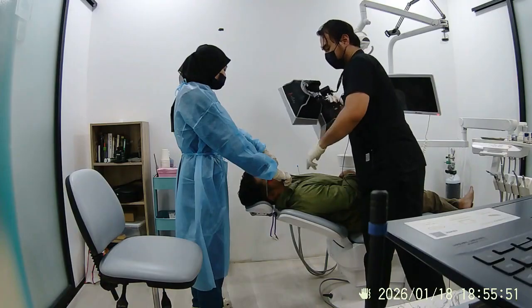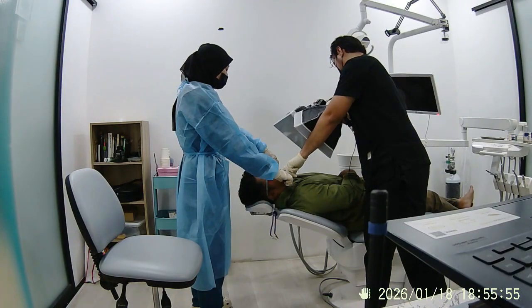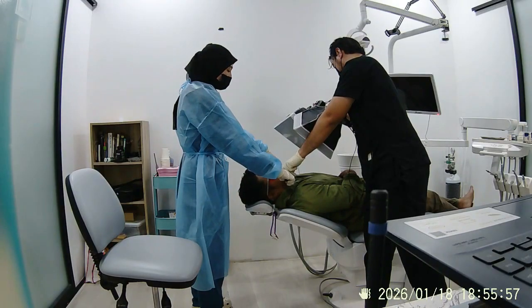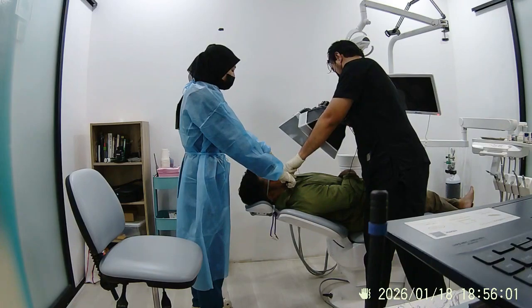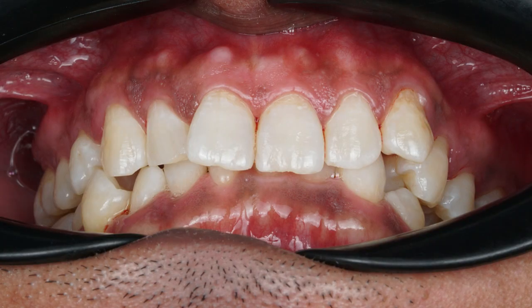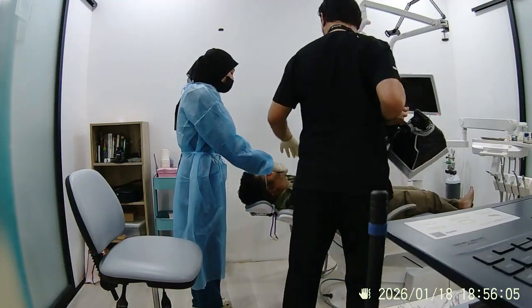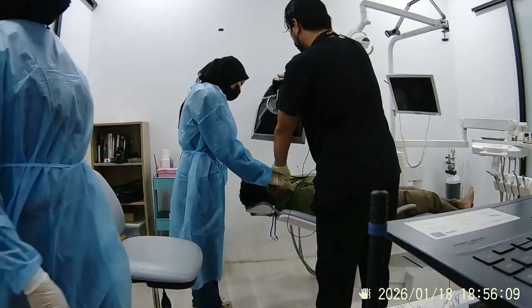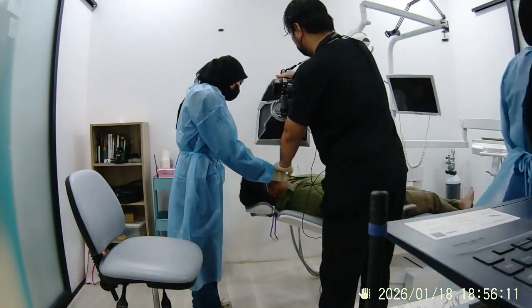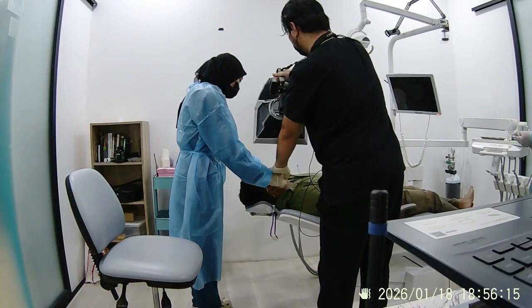Alright, as you can see in this video, I am not speeding up the video and it is in normal speed. The reason is for you to appreciate, at normal speed, how fast the total intraoral photography actually took. It's less than 3 minutes. On average, it's around 1.5 to 2 minutes, if done right, with a sufficiently competent assistant at the site.